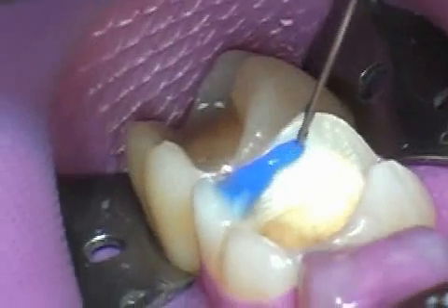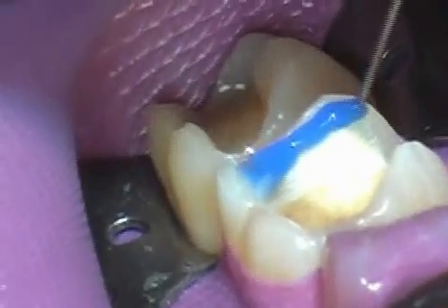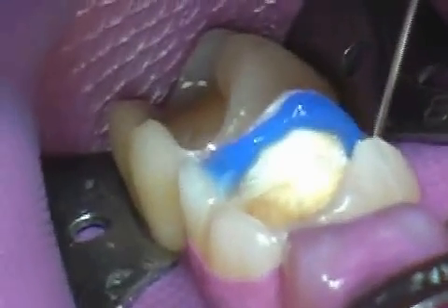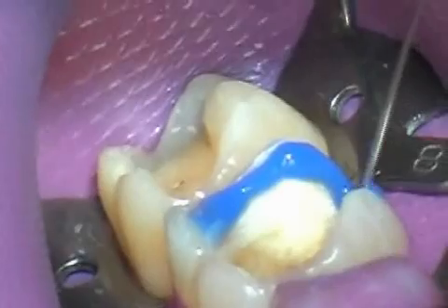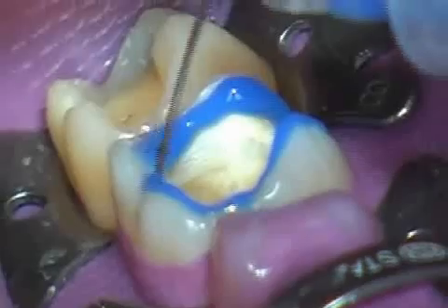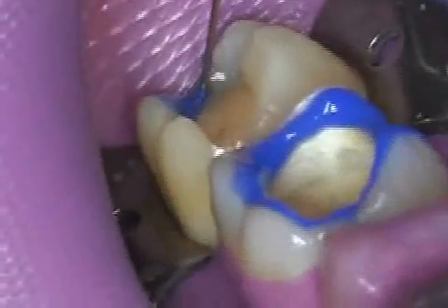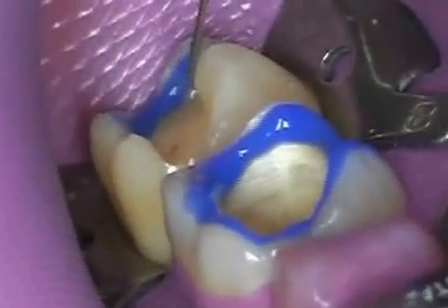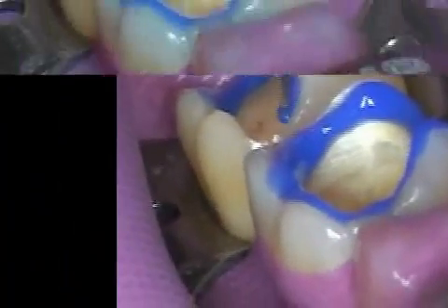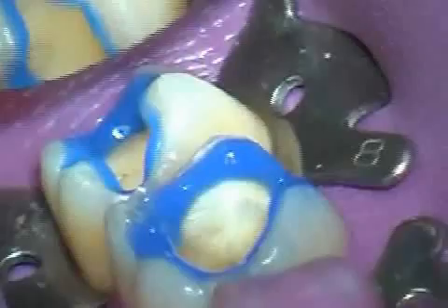This is not just abstract theory — this is how it works in practice. The tooth is surrounded by the cofferdam, shown in violet, and has been ground for a ceramic inlay. Before the inlay is glued, both the surface of the tooth and the inlay are etched. The etching gel, shown here in blue, is applied to the clean tooth on the enamel first. The enamel is easy to see in white, and under that the yellow dentine. A magnifying glass makes this even easier to distinguish. The etching gel is left on the enamel for a few seconds.